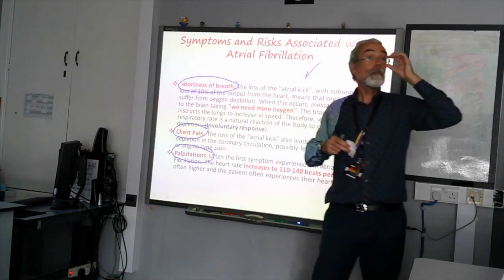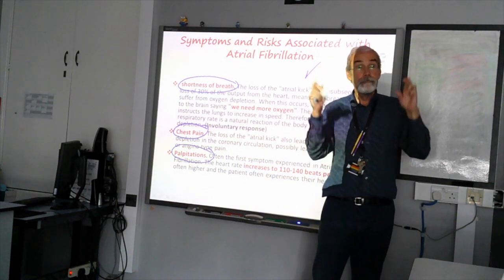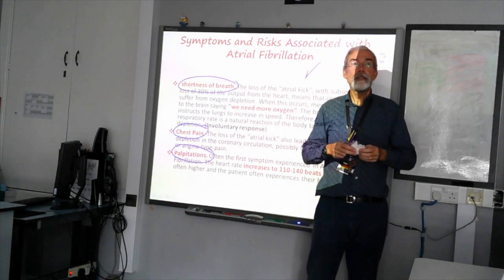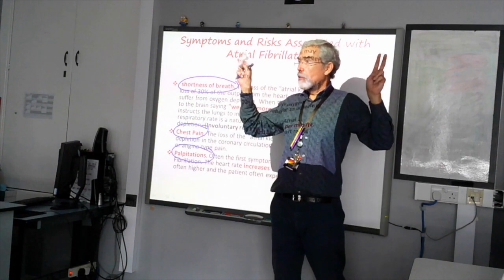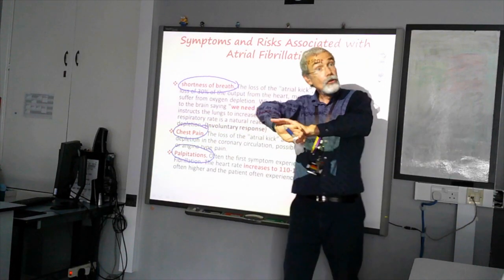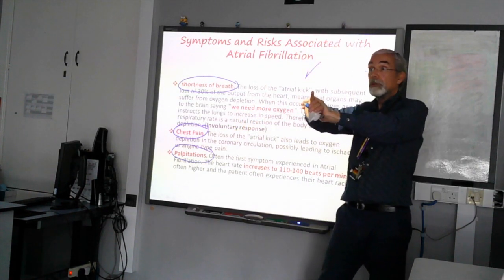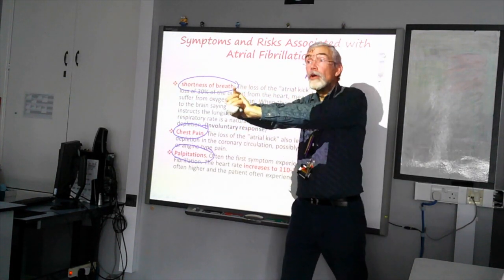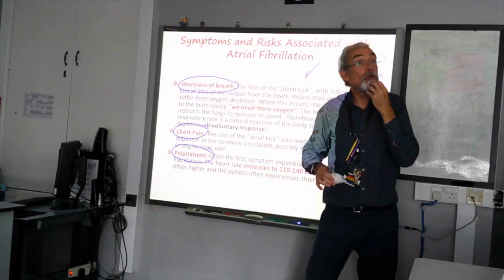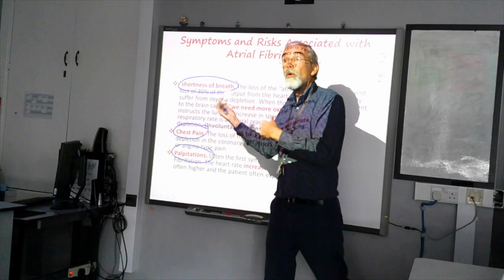How likely is it that it just wants to go back on? It's not quivering. I've got more than 50-50. It is the weapon of choice to try and start everything going again. It is much better than doing CPR. Because in CPR, when you're pressing on the heart, you are pushing blood through the ventricles, and when you are blowing into the person's lungs, you are charging it with oxygen. So you're externally doing what the heart would do anyway.